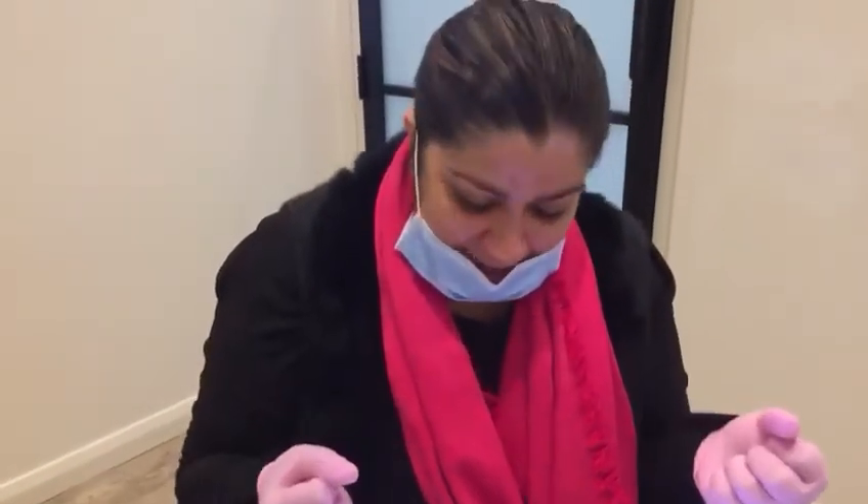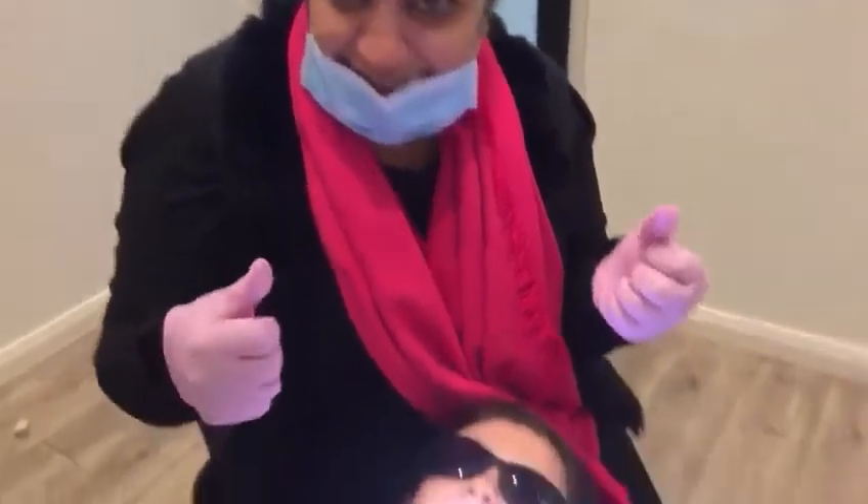If they swallow them accidentally, that's okay. Just make sure they don't have chewy or very hard foods that can pull them out. And she'll come back this afternoon to get her expander. Thank you.